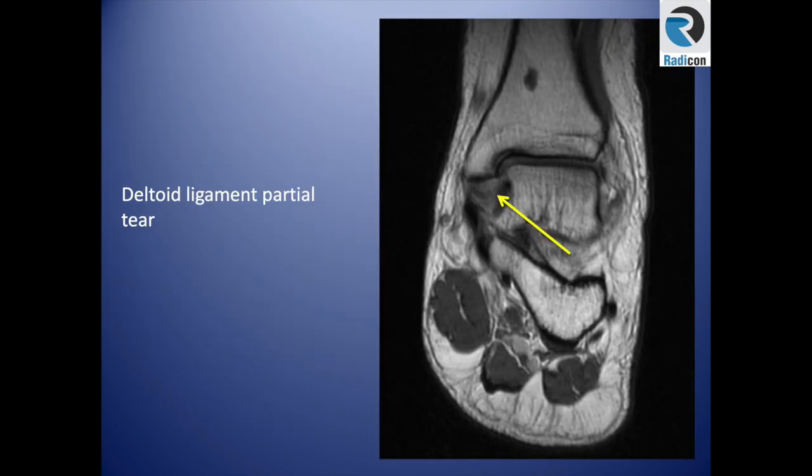The deltoid ligament normally has a fanning appearance. If you lose that and see thickening with edema, that indicates injury within the deltoid ligament.